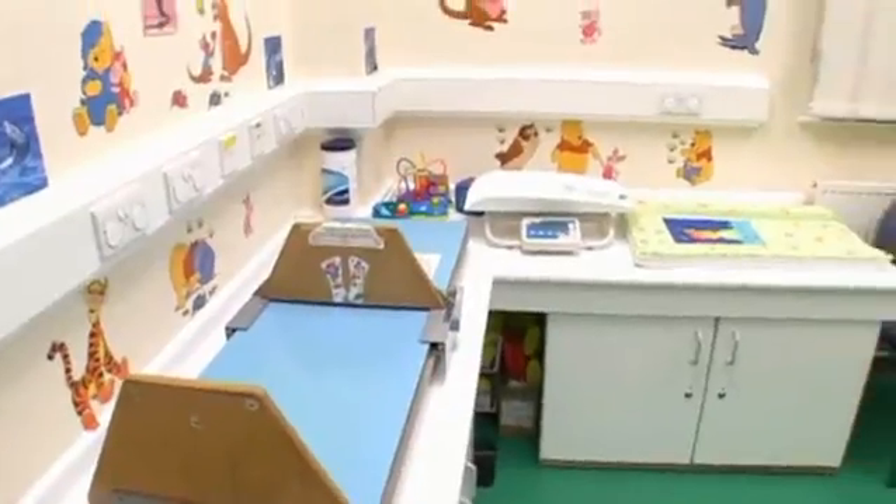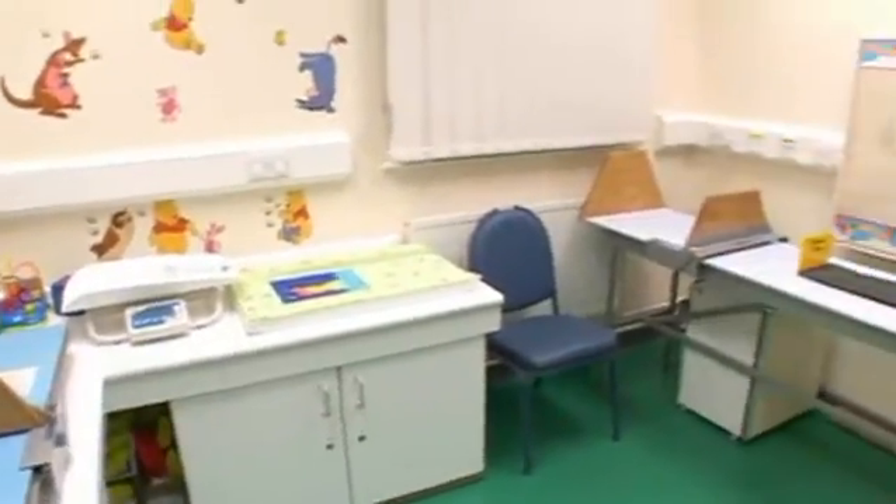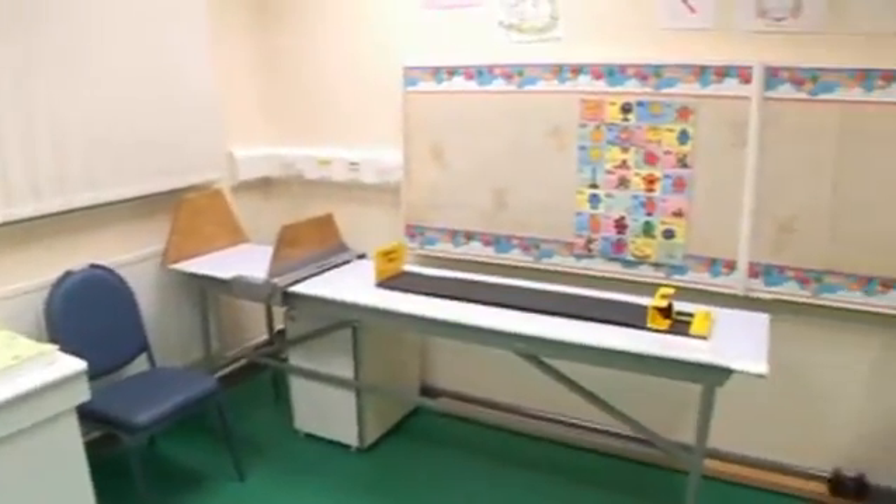So how do you go about getting accurate measurements of height, weight and head circumference in children? As you can see, here at Sheffield Children's Hospital, we're very fortunate that we have our own dedicated area. What then are the essentials, Sally?